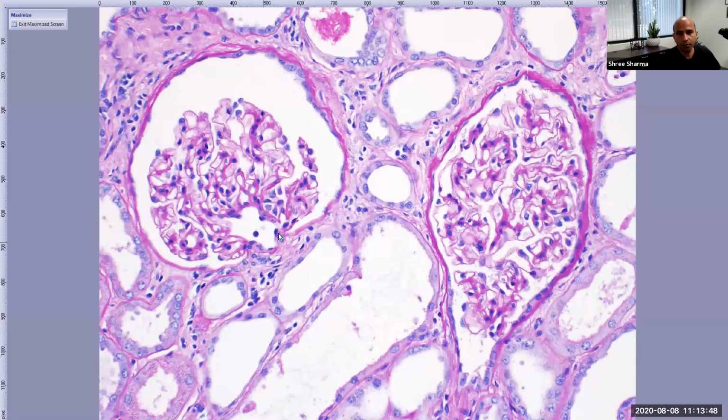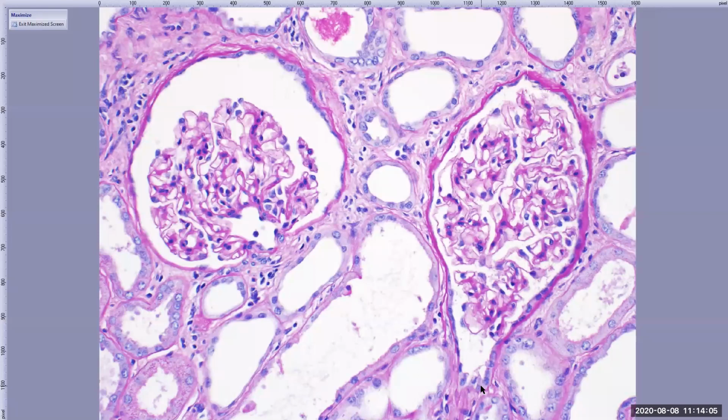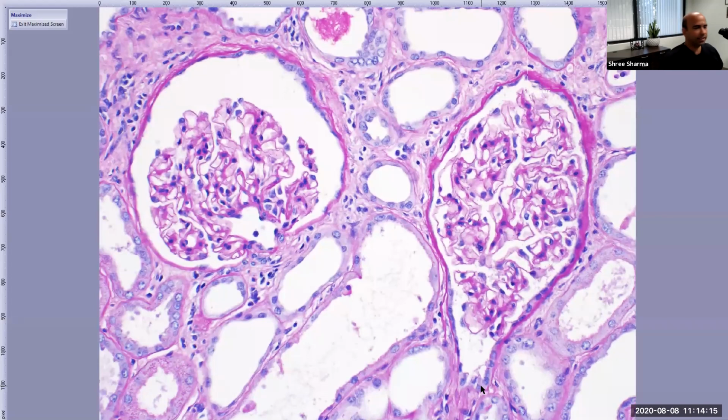This is the hilar pole because it is the place where the blood vessels enter the glomerulus. This is the hilar pole, and this is the tubular pole. See, the tubule is continuing over here along with the Bowman's capsule. The parietal epithelial cells are getting, can you keep that there for a second? I need to take a picture of that. That's absolutely gorgeous. Yeah. Okay. And I will tell you the importance later on. You can go on now.